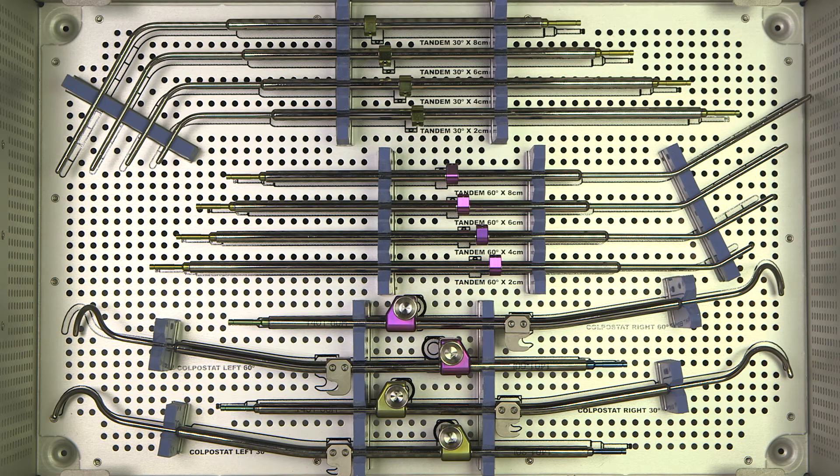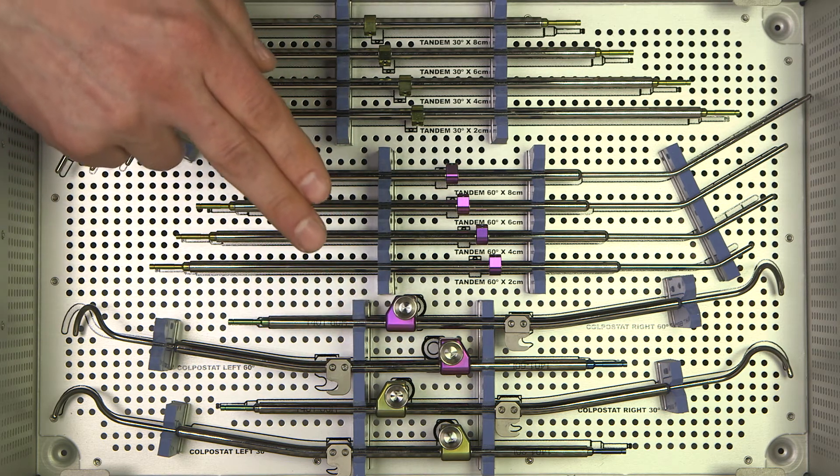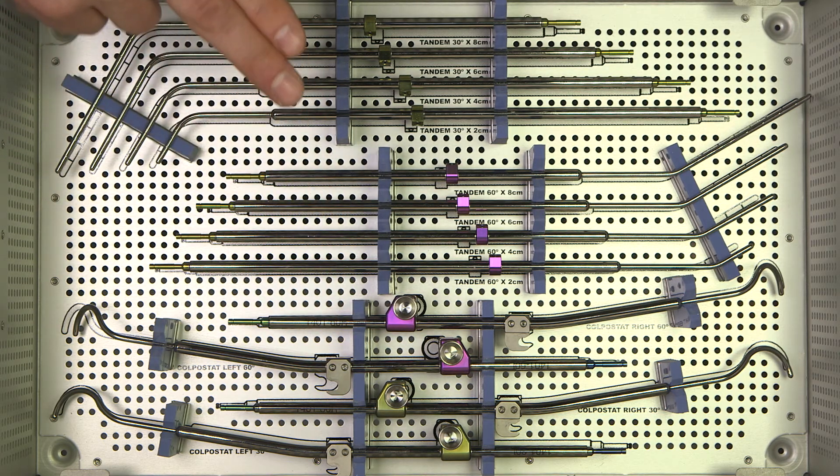The 3-channel split ring applicator combines the benefits of the flexible Fletcher applicator with the fixed geometry of the ring applicator. Due to its unique patented split ring design, it allows for easy insertion into the patient and due to the snap and angle lock, it allows for easy recreation of the ovoid angles from fraction to fraction. The set consists of rings and I.U. tubes in different angles and lengths.